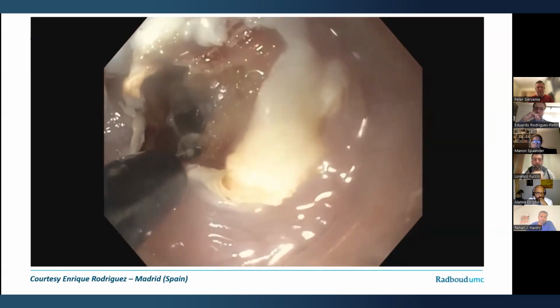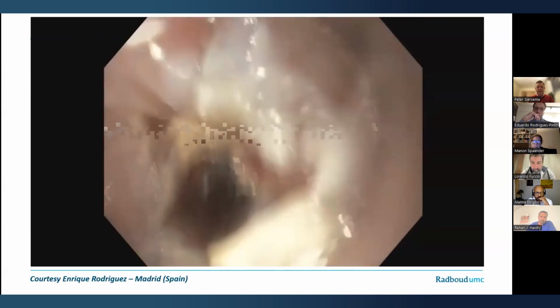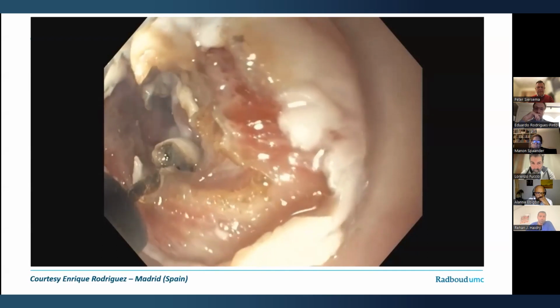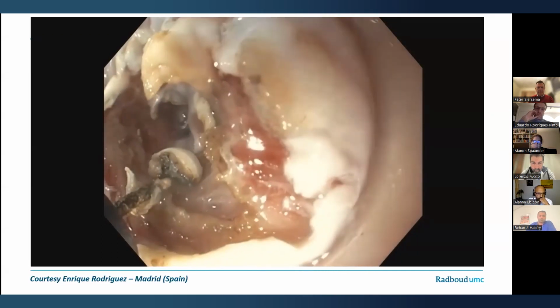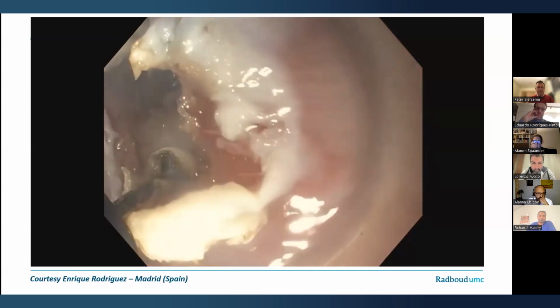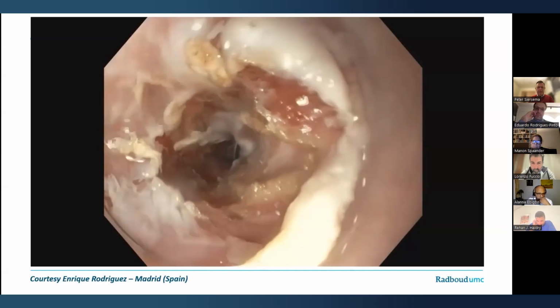And here you see the result coming. You see that the anastomotic stricture is nicely opening up, and at the same time you see that also the first fibers are being seen here, and that means that it's the point of stopping further incising.